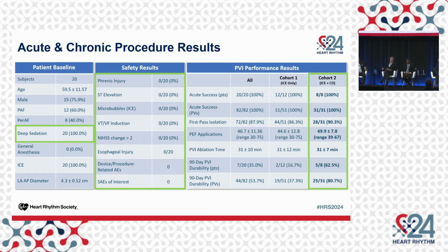If you look at the characteristics, these are 20 patients. All of them, on the very left at baseline, underwent deep sedation only with propofol. Depending on your country and regulatory reasons, in the US most of us need an anesthesiologist for propofol, and in many countries in Europe there's a nurse-driven protocol. But the degree of anesthetic required when you don't have to put a tube through the vocal cords is substantially less. Important to safety, we didn't see any acute safety events with all of those things you see on the screen, including anything procedural or device-related, ST changes, and importantly, no microbubbles.